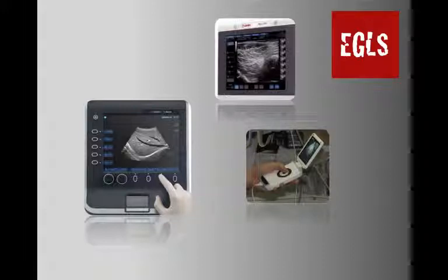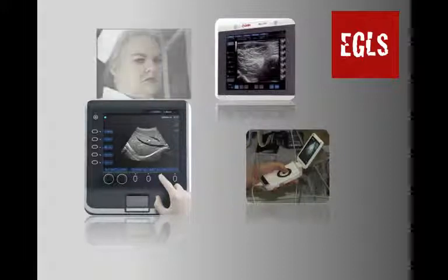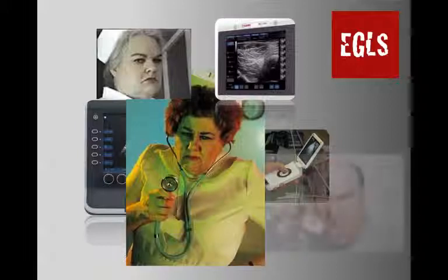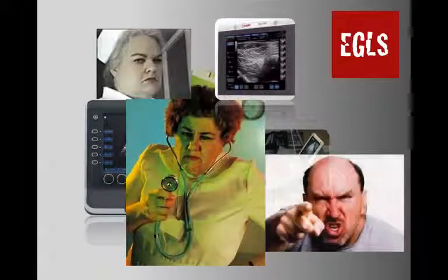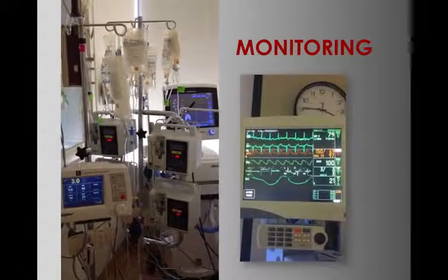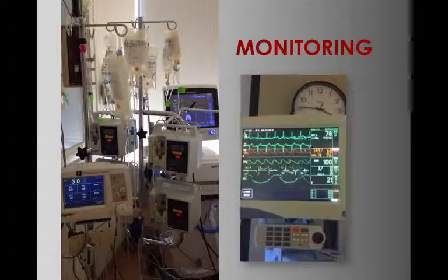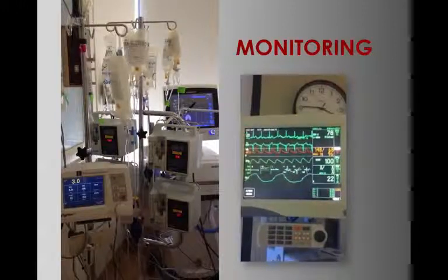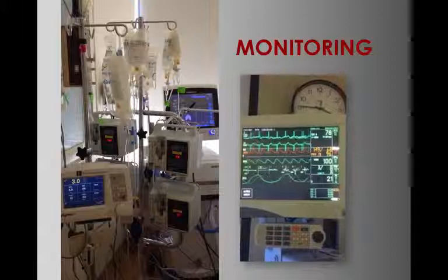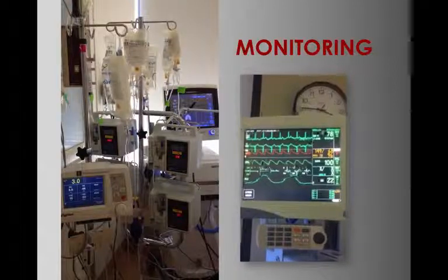And we'll get to a point where we have to look at a somewhat skeptical nurse and tell her, yeah, give him another liter of fluids. No, he won't be in pulmonary edema. And when it's not clinically evident anymore to say if our patient is still fluid responsive or not, he'll often be moved to the ICU, where monitoring tools will help the intensivist evaluate the patient's hemodynamic state. But ultrasound is a great portable monitoring tool. We can assess preload, cardiac function, and the lungs.